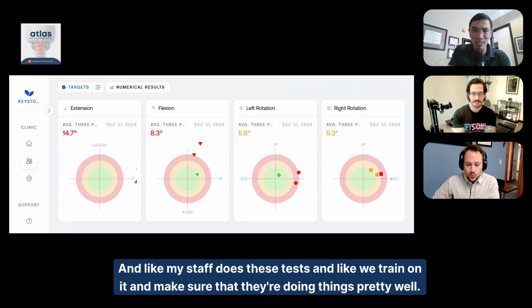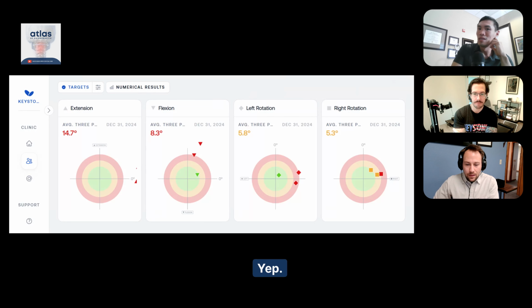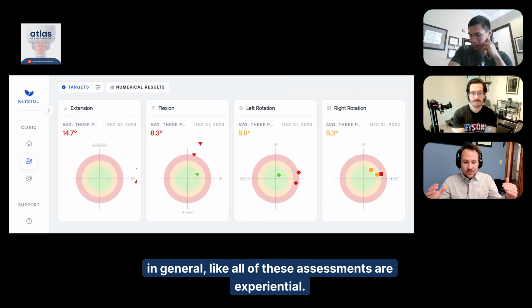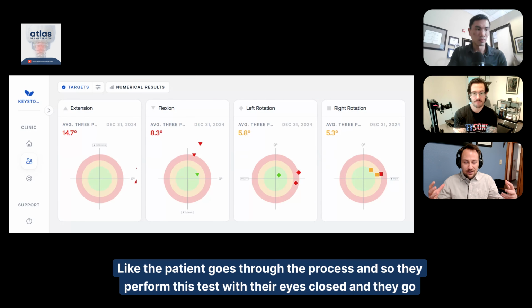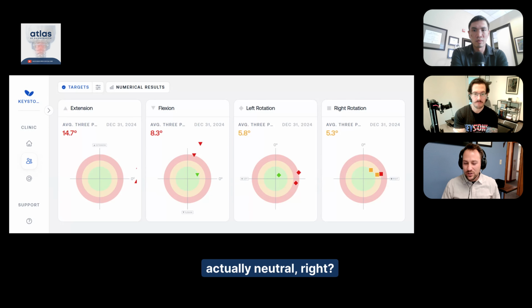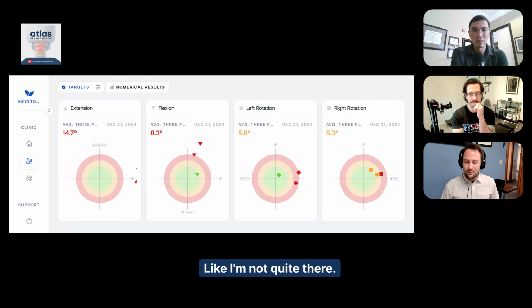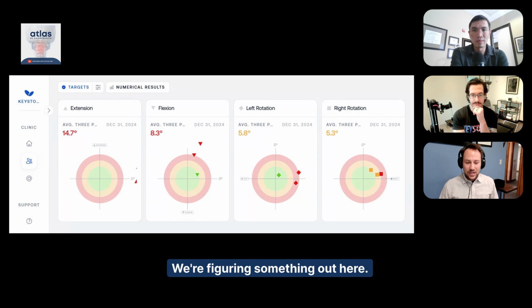My staff does these tests and we train on it and make sure that they're doing things pretty well. So I know the type of data that we're getting is going to be good. And experientially in general, all of these assessments are experiential. The patient goes through the process, and they perform this test with their eyes closed, and they go back to where they feel like they're neutral, and then you reposition their head back to what's actually neutral, right? So even experientially, there is this feedback that patients get going through the assessments that like, ooh, something's up here. I'm not quite there. We're onto something. We're figuring something out here. And I think that's valuable.